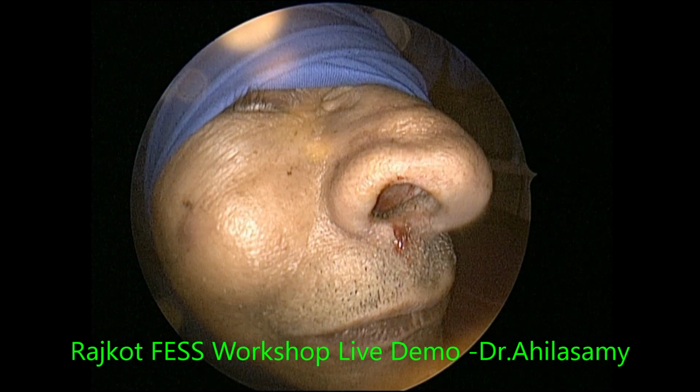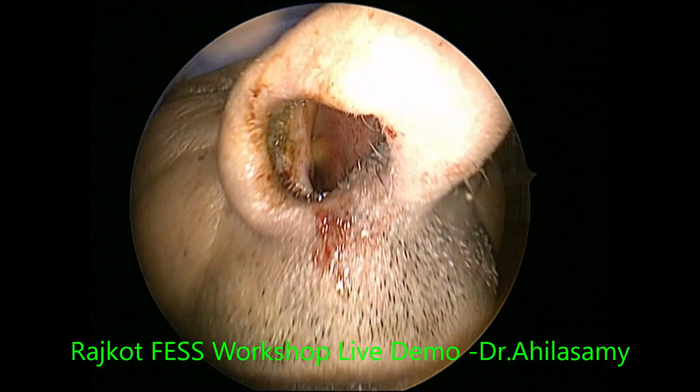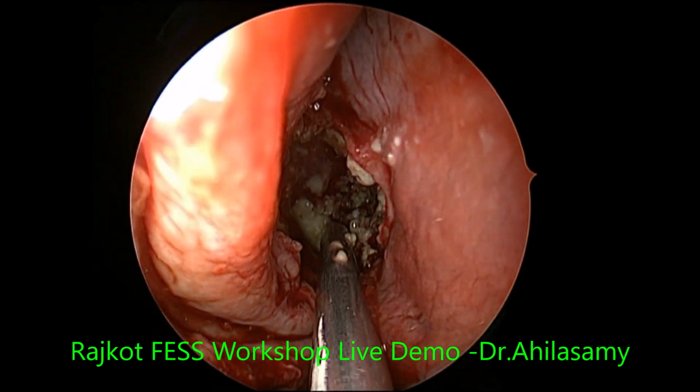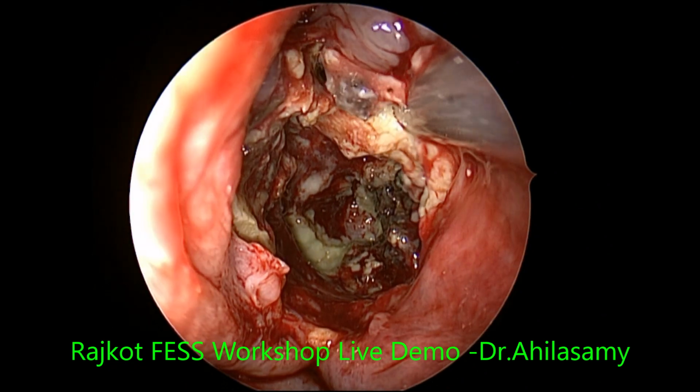My sister, you are sleeping. You should look at me. This patient should look at me. She was turning to her side. She wants the patient to look at her. So always the patient should look at you, and you should not lose the camera.